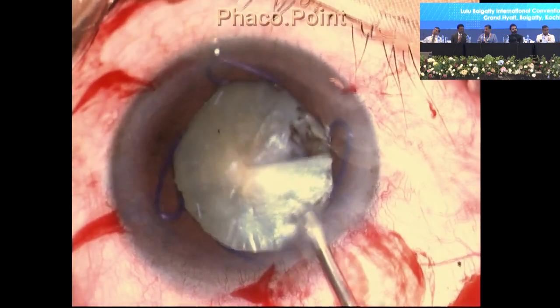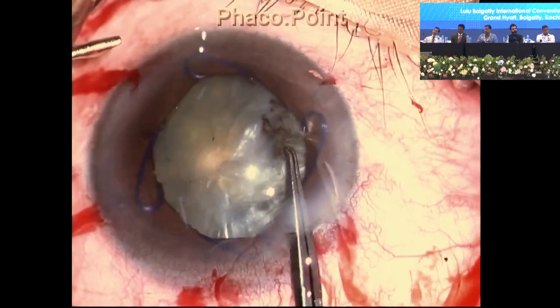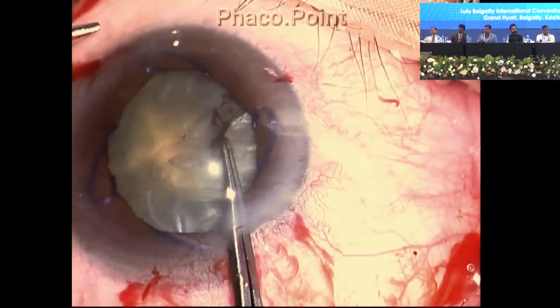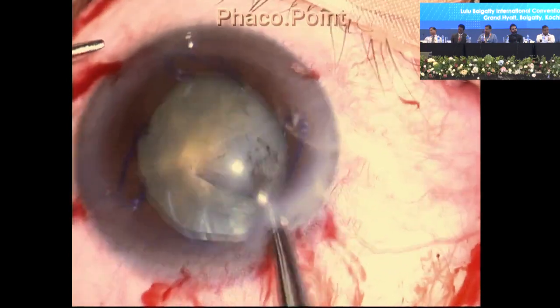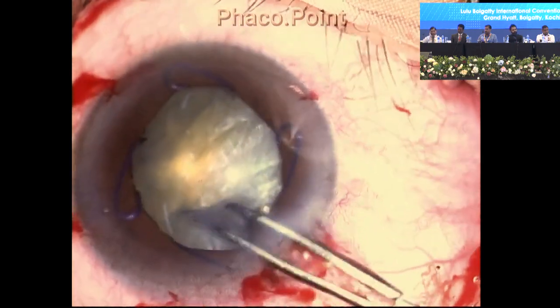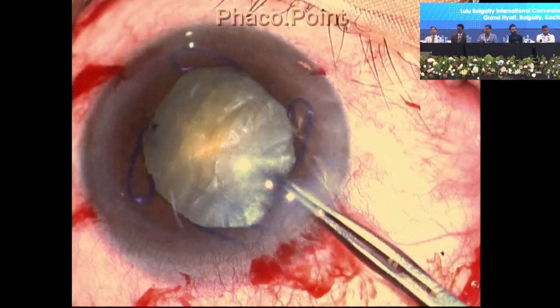Under a viscoelastic cover, the surgeon then introduces a utrata forceps, holds on to the torn anterior capsule closest to its edge, and starts to pull inwards. While attempting to pull inwards, he uses so much force that the tear actually extends to the other side at the 2 o'clock position. So now we have 2 tears in the anterior capsule that have extended out towards the periphery. The utrata forceps is now reintroduced and the surgeon just pulls on the anterior capsular edge and draws it in to complete the rhexis.